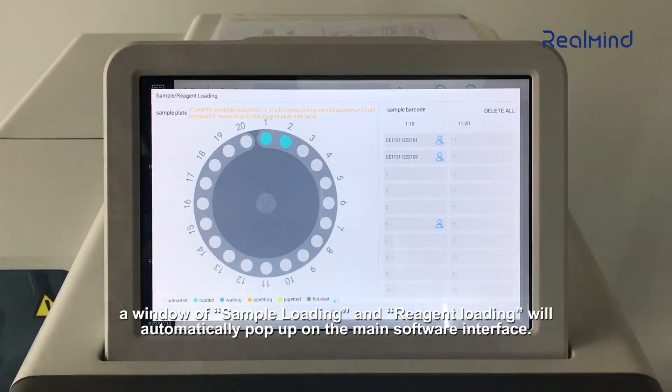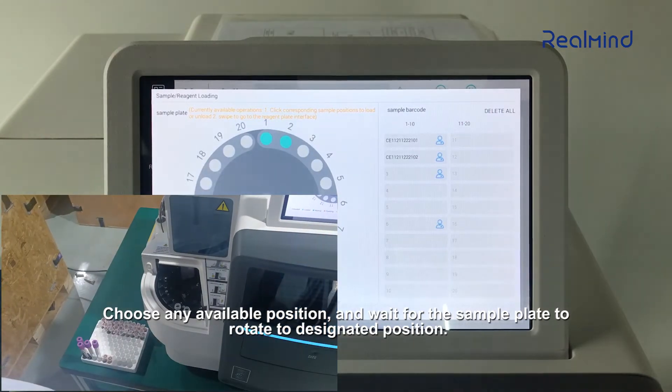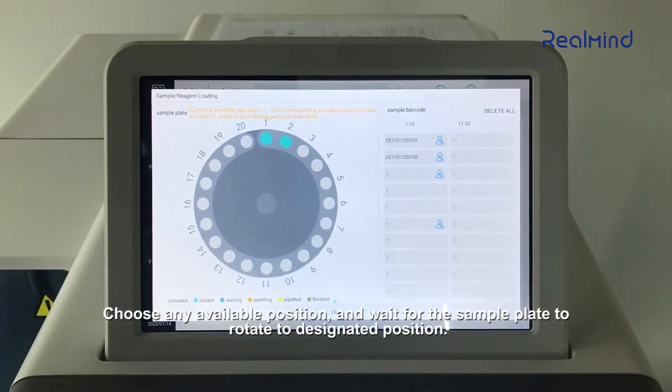A window for sample loading and reagent loading will automatically pop up on the main software interface. Choose any available position and wait for the sample plate to rotate to the designated position.